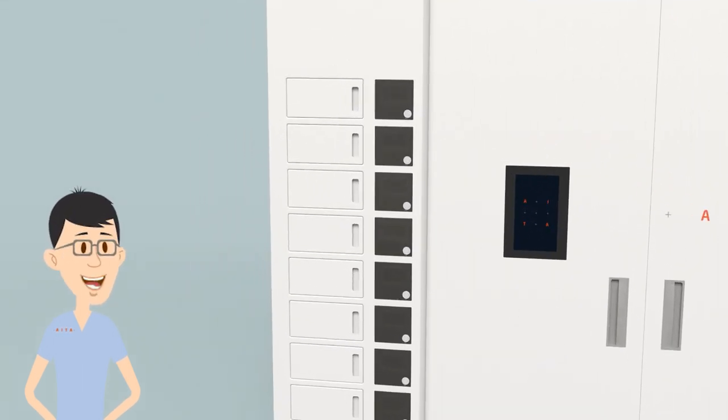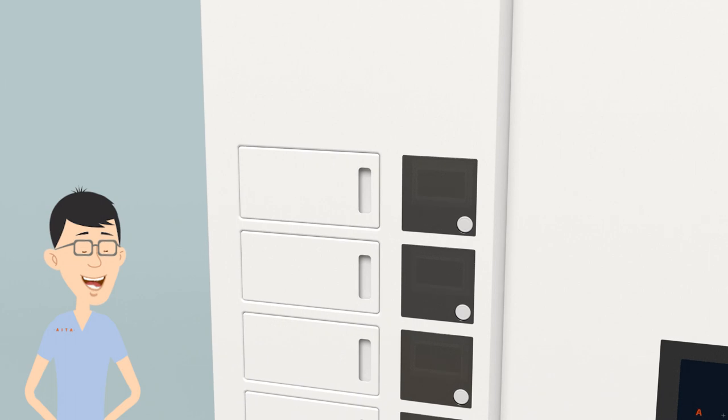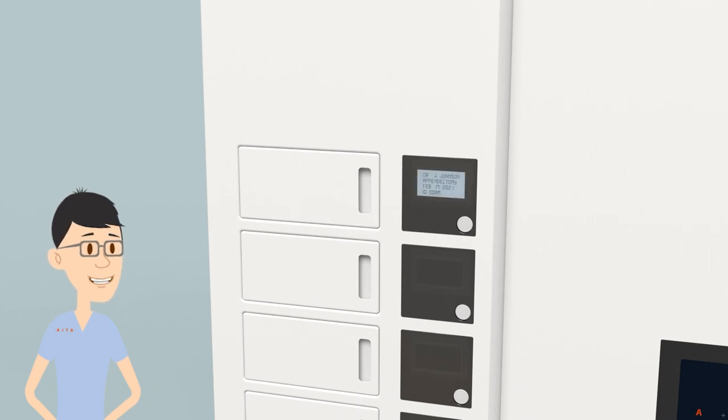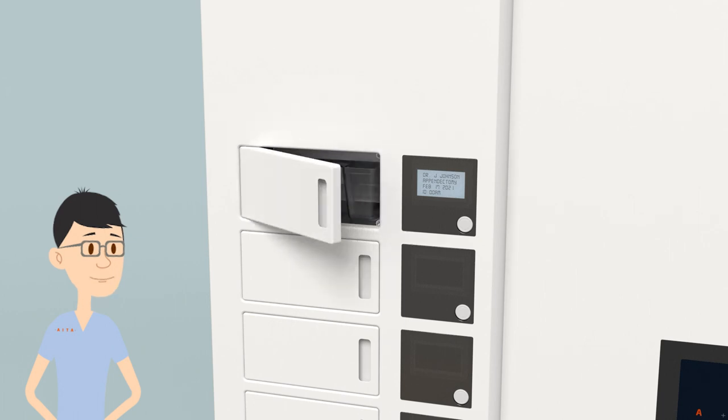To retrieve products at the AITA kiosk, review the locker displays to find the details of the case that you are picking for.